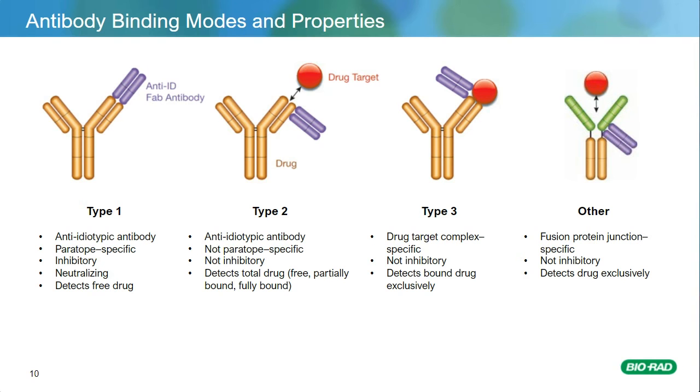Also, if you think about therapeutic antibodies, they're also present in a background of highly similar proteins. In this case, the therapeutic drug antibody is present in a background that contains a much higher concentration of a patient's own antibodies. So you're trying to discriminate between a drug antibody and a human antibody background.